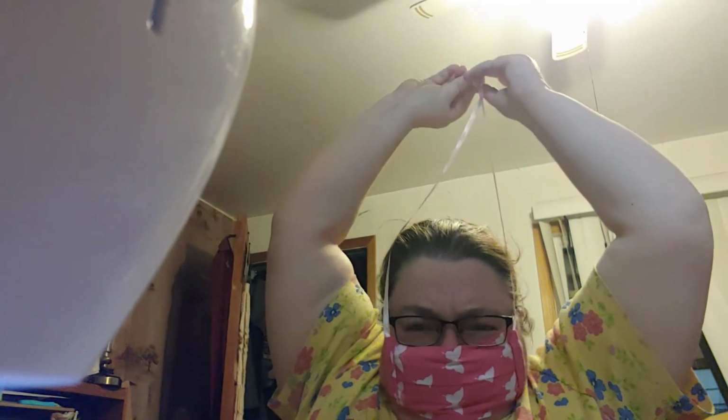I got short arms. Or you use the little doohickey. Okay, I prefer the bow. This doohickey is made for larger cords, so it's not holding up as well. But comme ça. So you can see the cord, it should be tight. It would be usually attached here.